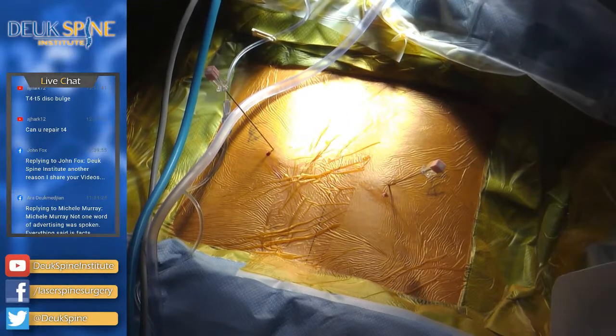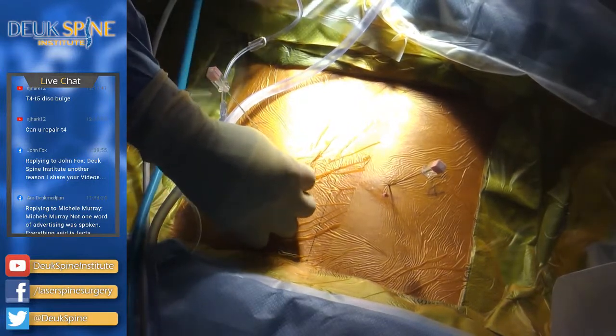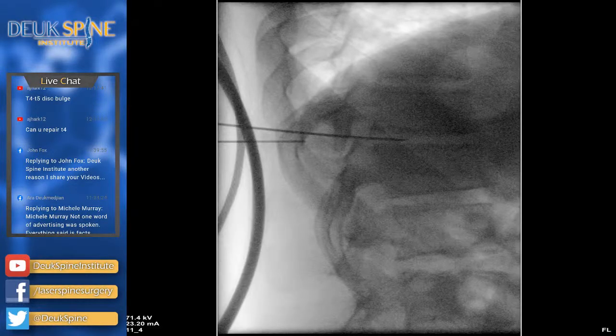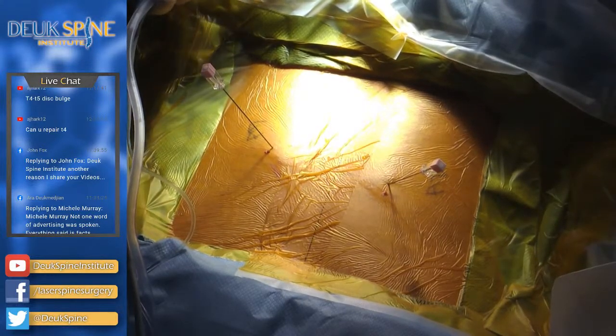So I think we need to wag a little bit. If your fluoro picture is not, that's better. If the fluoro picture is not perfect, I mean, as close to perfect as you can get it, obviously, then your trajectory won't be accurate. So I want to make sure that what I'm using to navigate is as close to perfect as we can get it. So that's one of the rules of navigation. If your navigation system is inaccurate, then of course your navigation will be inaccurate.